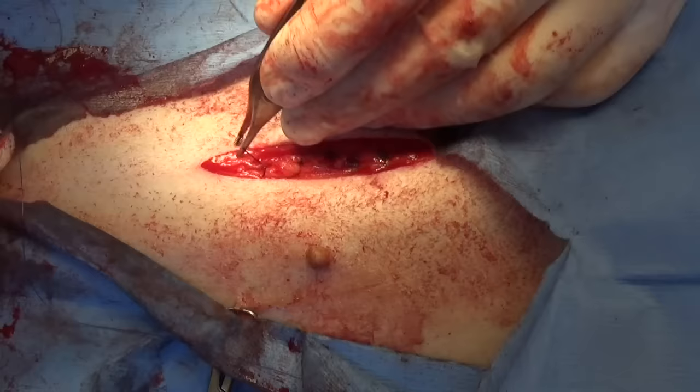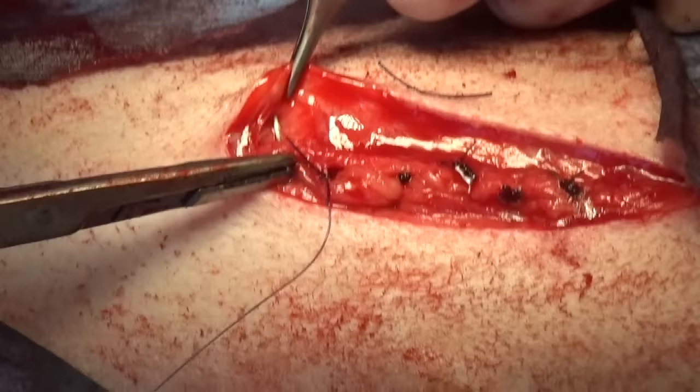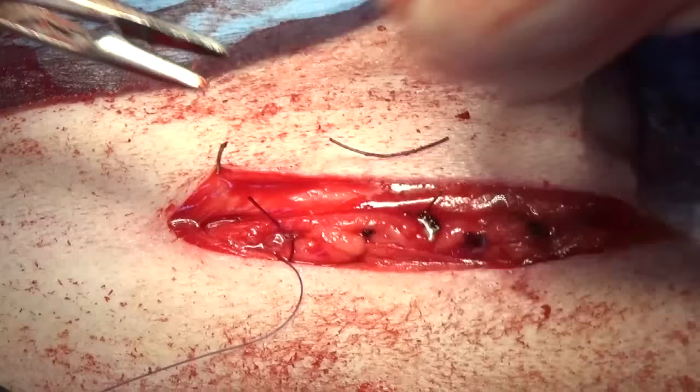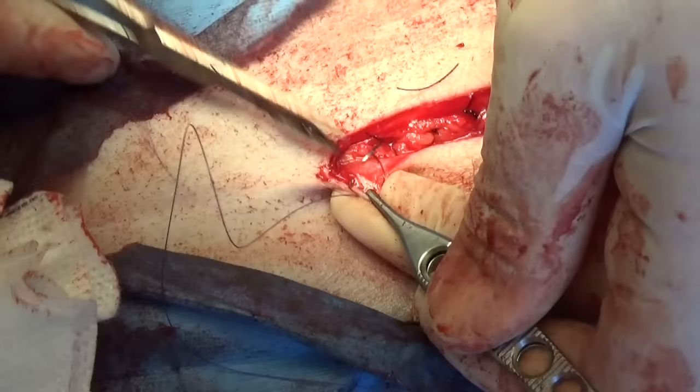Now this is a sub-Q stitch, watch this. And the sub-Q down here, and up, going up like an arrow in the sky, going up. And then back down, the arrow comes back down and goes to the other side. This is a great holding stitch.